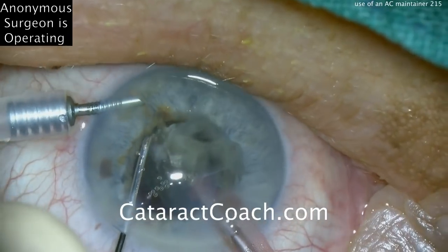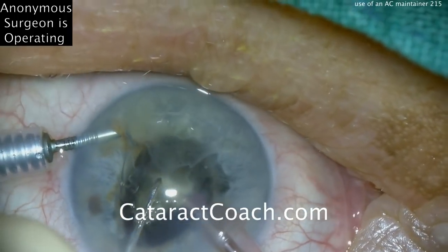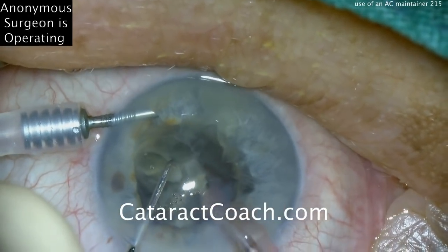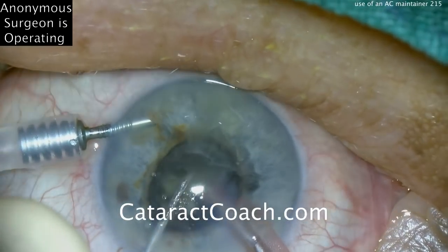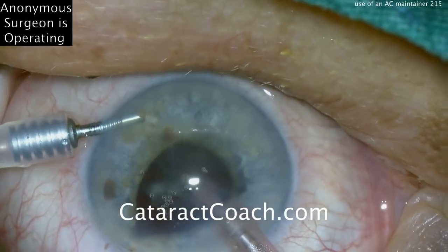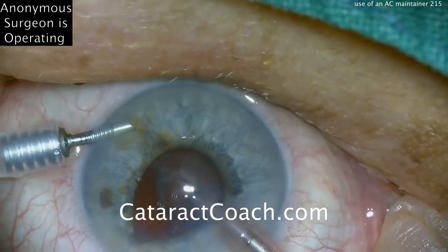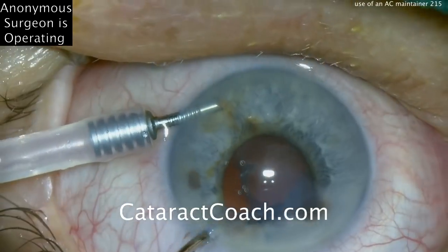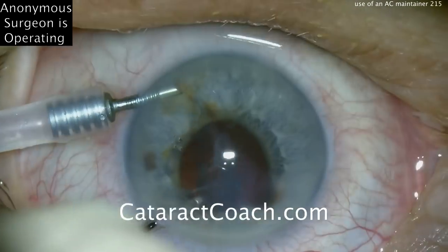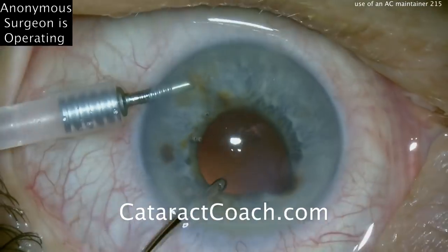There's the last piece coming up at the iris plane, with a little manipulation from the chopper and a little bit more energy to remove it. In most of my videos, I do use the chopper in a safe mode to help prevent the posterior capsule from coming forward. In this situation with the anterior chamber maintainer, it's much less of a risk. Taking our time to finish up the last bit of lens material. Now just using an aspiration device through the paracentesis — you don't need the irrigation-aspiration handpiece because inflow is already coming from the AC maintainer, so you just need an aspiration device, which makes it a lot simpler.